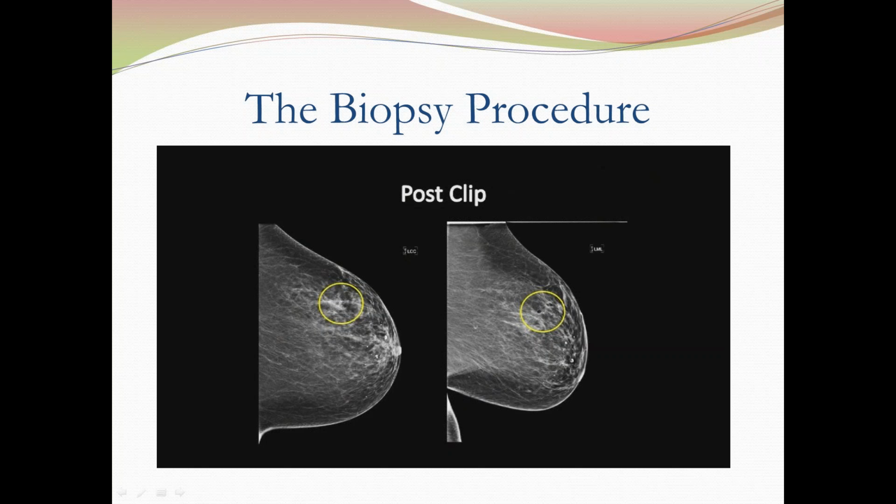Another question from Val Smalley. What is the cost of a tomosynthesis machine? You know, the cost is typically, I'm just going to give you a ballpark. Just to give you a frame of reference, a digital mammography machine is probably about $125,000. A tomosynthesis is going to be closer to $300,000, so considerably more.